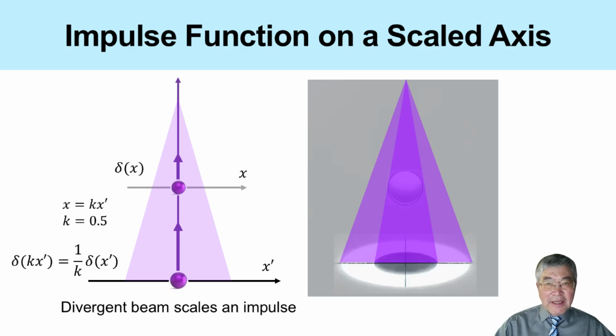The same idea also applies when we move from a one-dimensional detector to a two-dimensional detector. So fan beam projection is different from parallel beam projection in two important ways. One is the detector obliqueness, which we just discussed. The other is beam divergence, which creates geometric magnification. Both effects must be corrected in the fan beam reconstruction formula.